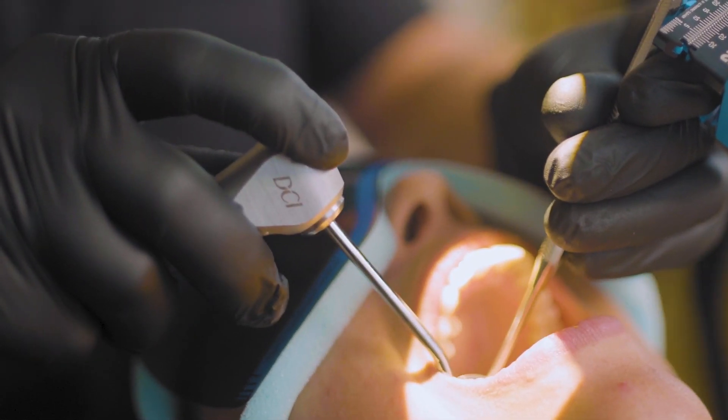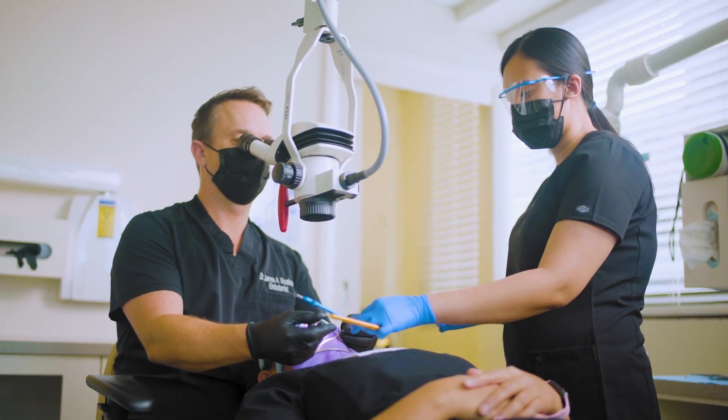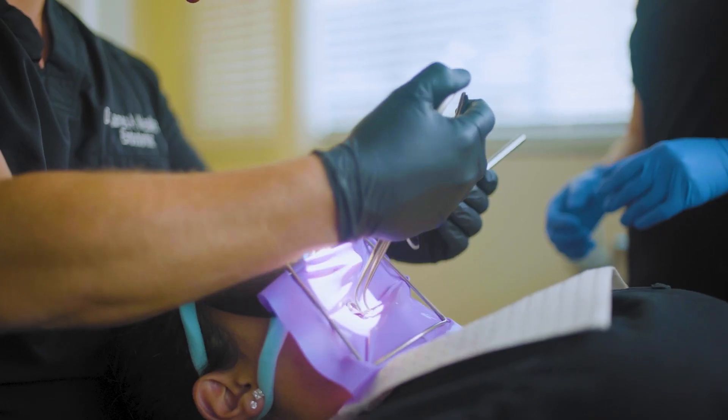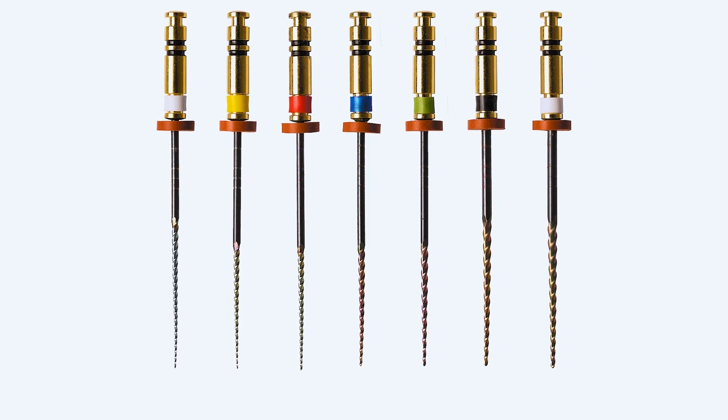I've been using Edge Endo for about eight years. When I was out in Okinawa, Japan, with the United States Air Force, I got my first exposure to the Edge product. And normally it's quite hard for dentists to change over to a new product — the product really has to be a game changer.